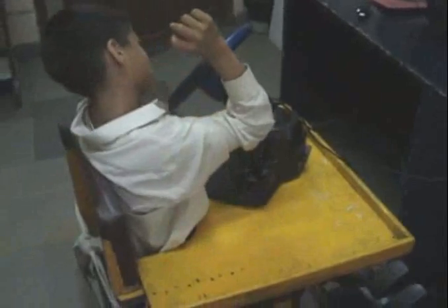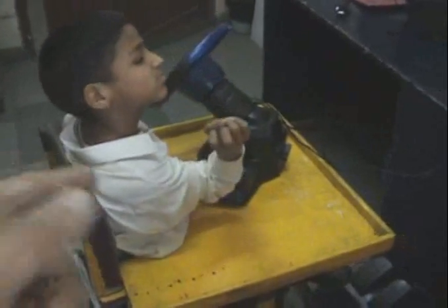Now he had to learn several things at the same time. He had to figure out what the buttons were doing, how to push the buttons, and how to rotate the wheel and press the pedals. And then he also had to figure out how he was going to best communicate to us that he had understood all this. Now he has to figure out which button is working for what, that also. I think that stick works best for the... Stick is working best.